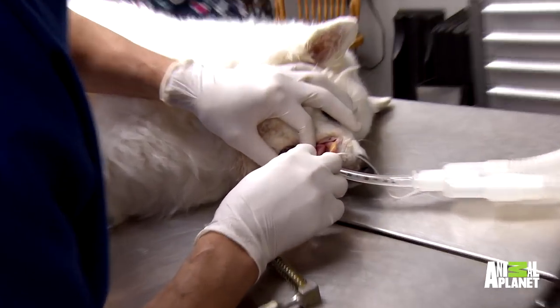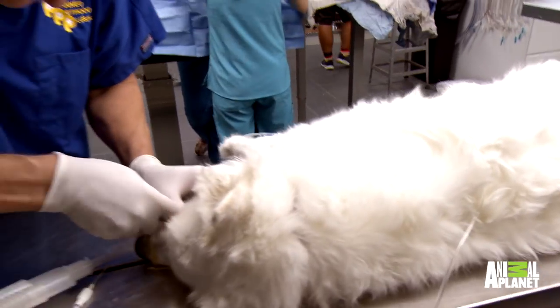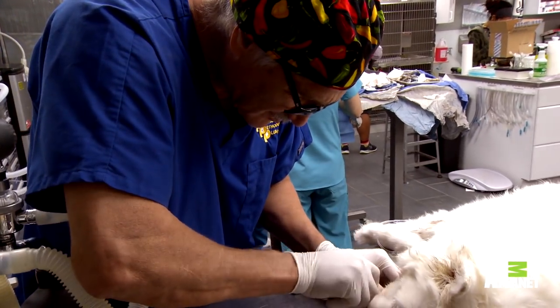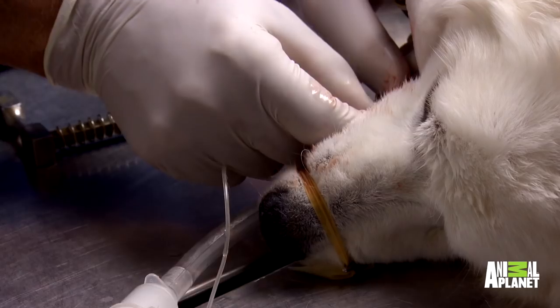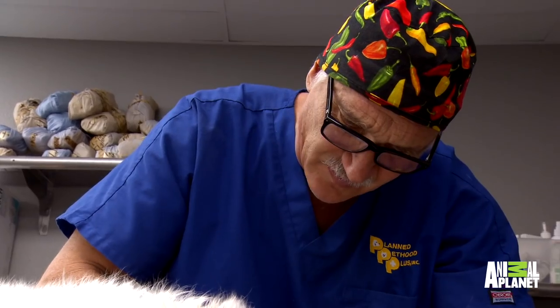These teeth are just rock. That tooth there — better to have it come out. Better to have no teeth than rotten teeth. Several of these teeth just want to fall out — just pushed it out.